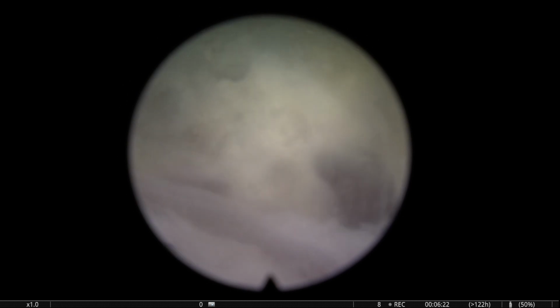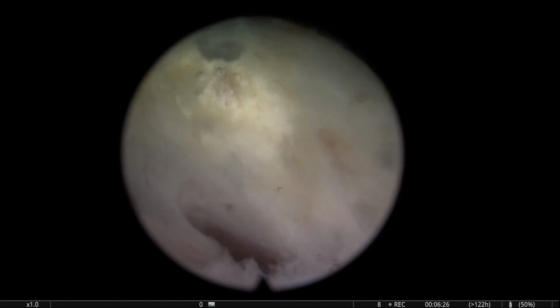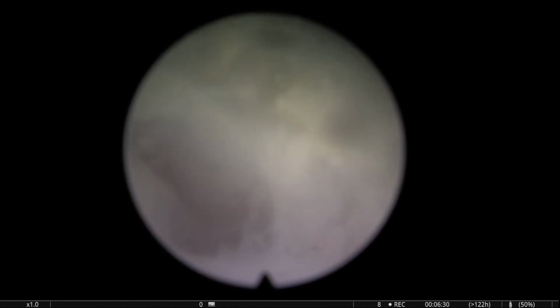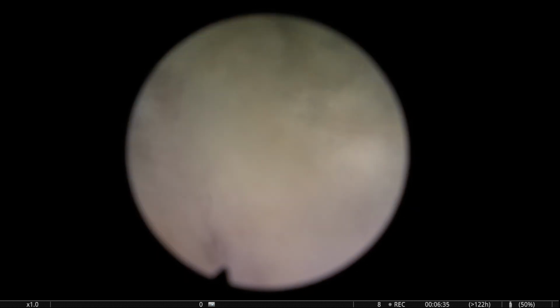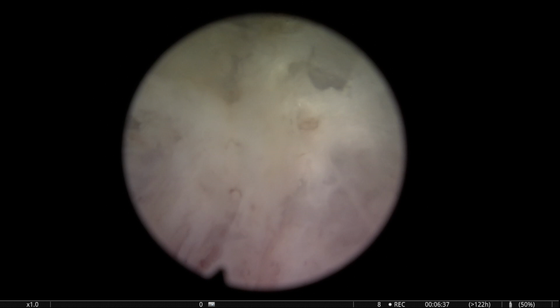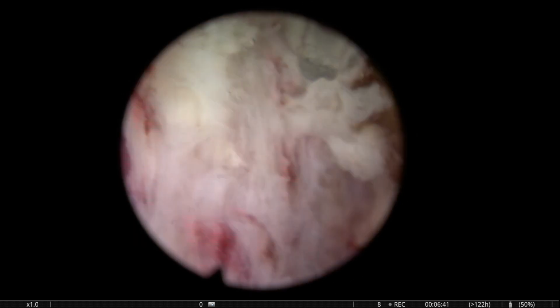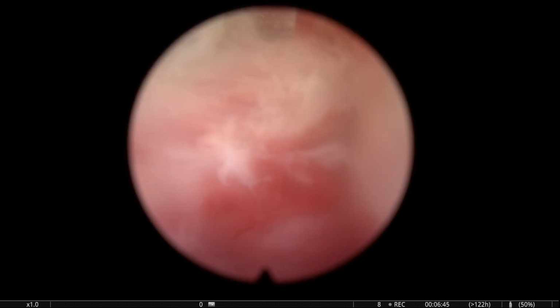You see, the movements are usually quite broad, in order to try to develop lines that we can recognize, lines that are, let's say, unique, so only one line, not many, and try to connect always these lines around the prostate, so we can have a nice reference system.